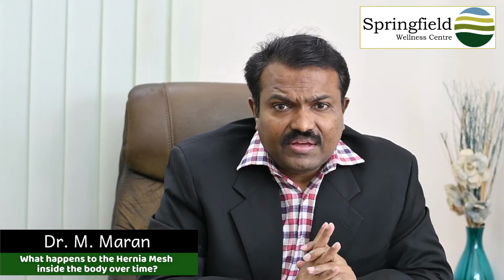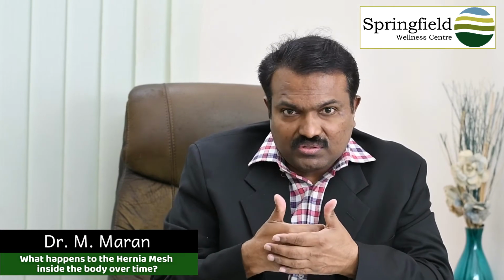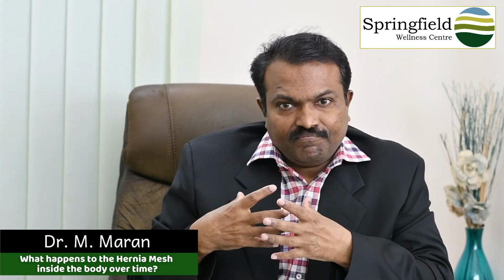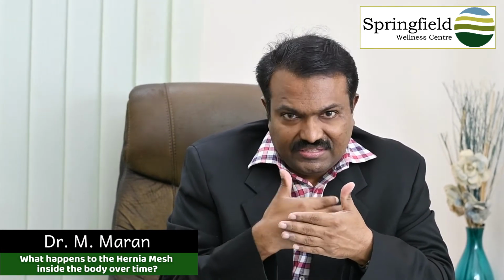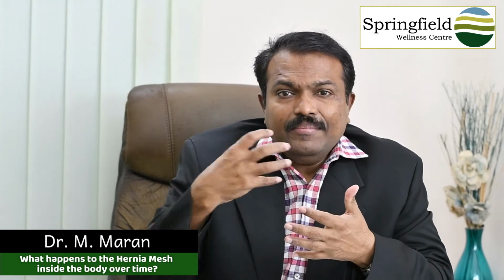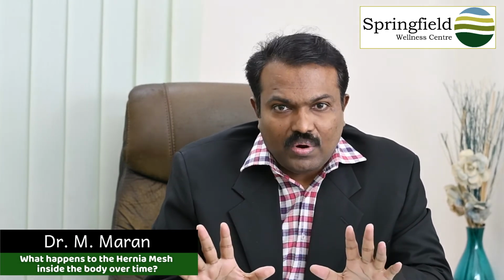Usually the hernia mesh is kept to repair or reinforce the weakest point in the body. That's a hernia. So we are reinforcing that tissue with a device, a medical device, an implant. It will be a permanent one. It will be there with your body forever. It will reinforce that particular area, mix with the tissues there, and remain in the body forever.